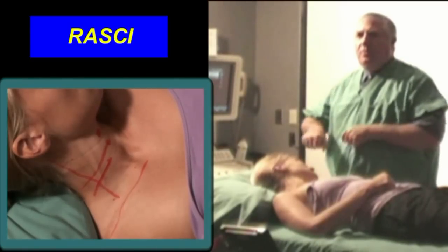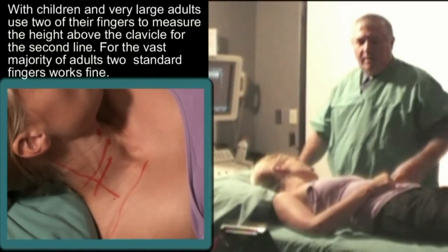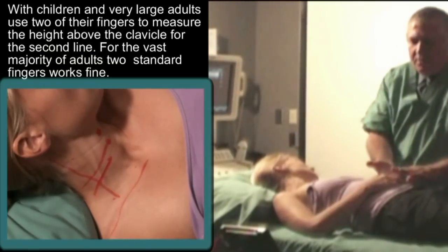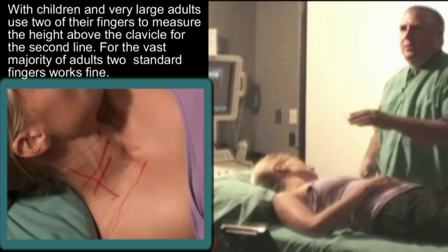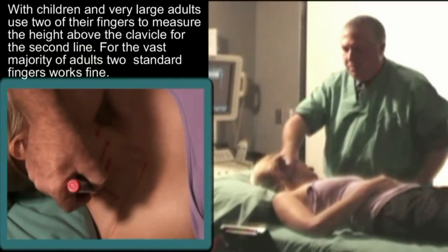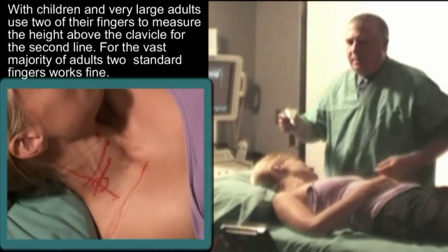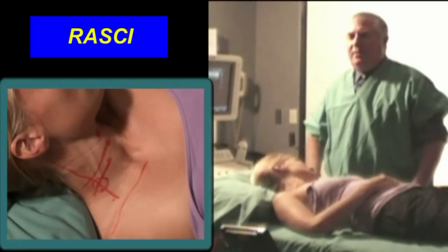It's also handy for children. If I'm going to do an interscalene block on a five-year-old kid, I will take the child's hand and approximate what two fingers of the child are, and use that measurement. You'll notice here she's got an external jugular vein crossing right through the point where I wish to do the block. That is fairly consistent, but don't regard that as a landmark. The external jugular vein is very variable.